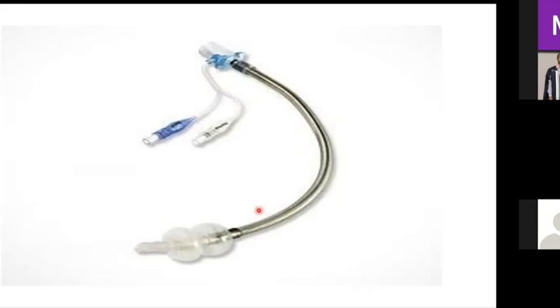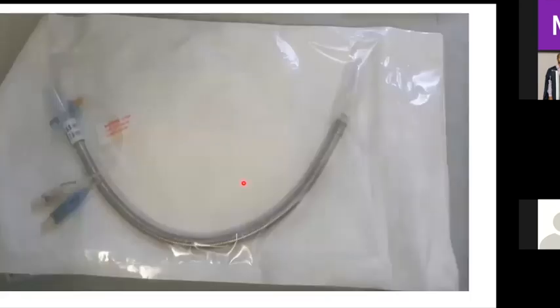This picture was actually taken in theater. So you can see it's a normal shaped endotracheal tube with two cuffs, a distal cuff and a proximal cuff. And you can see it has this steel casing surrounding the tube. So this is laser resistant. This is just to show the different laser resistant tubes.